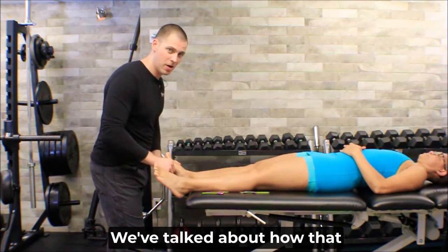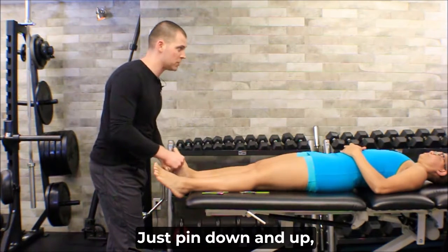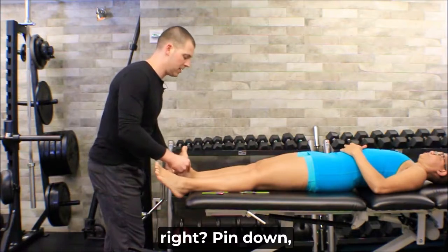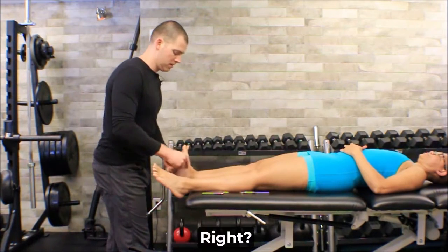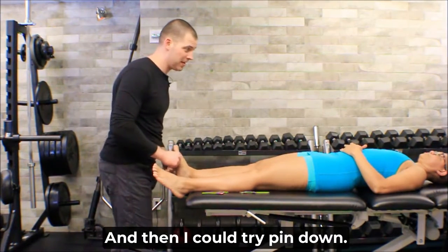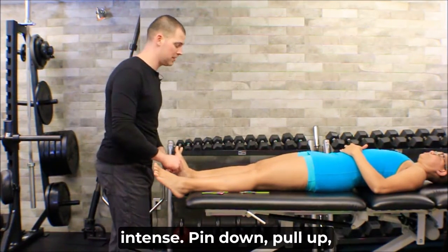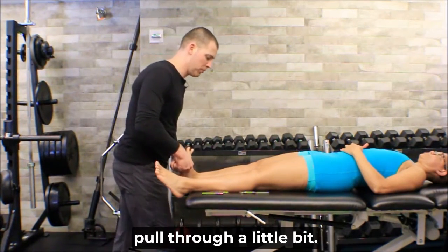And we've talked about how that might be the first step. Just pin down and up. All right, pin down, have her pull up. Right, and then I could try pin down as she pulls up. I'm pulling through a little bit. That'd be a little bit more intense. Pin down, pull up, pull through a little bit.